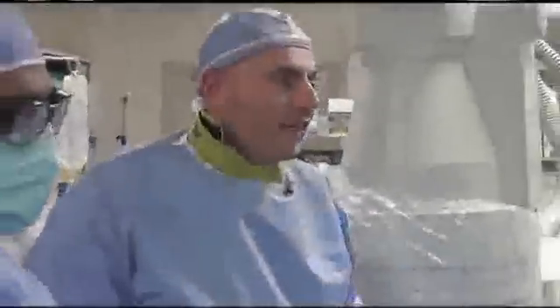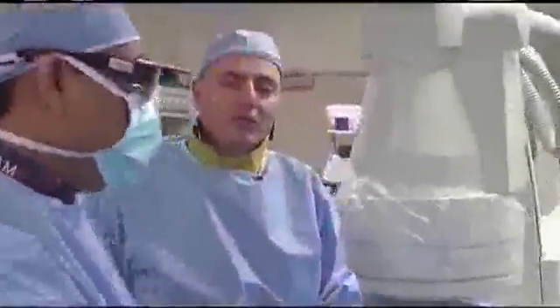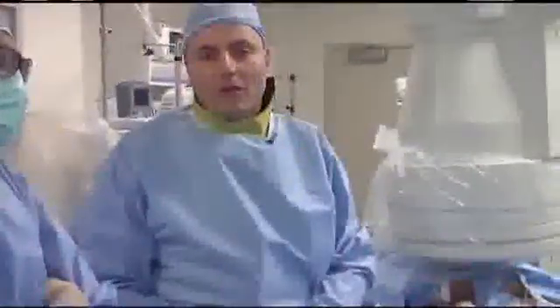So our choice is that I typically like to undersize it by 2 millimeters. I think this is maybe a 7 or 8 millimeter vessel. I'm going to use just a 5 millimeter balloon for pre-dilatation of the chronic total occlusion, and then from there I'll expand it appropriately after we take some pictures post-dilatation. And so we're advancing a 5 by 120 balloon through the chronic total occlusion over the 035 wire.